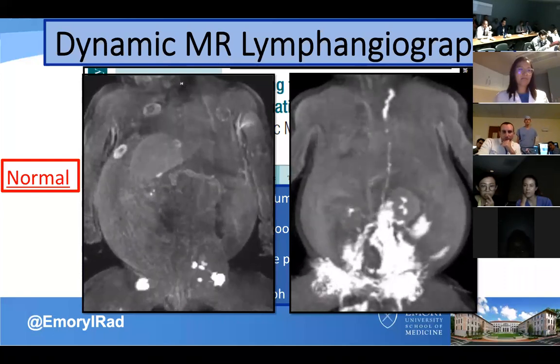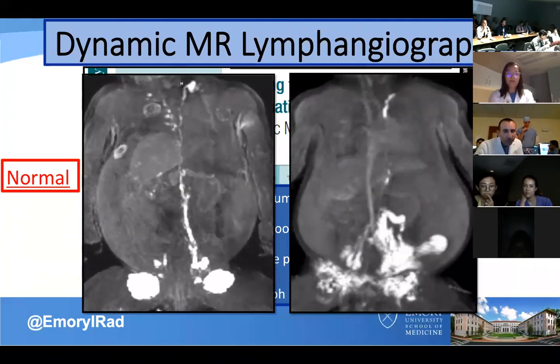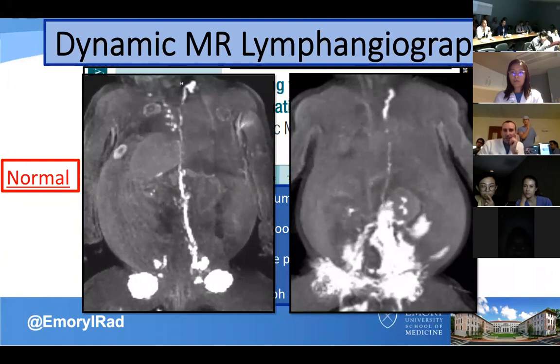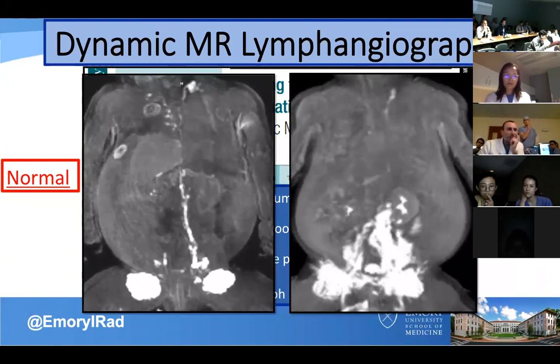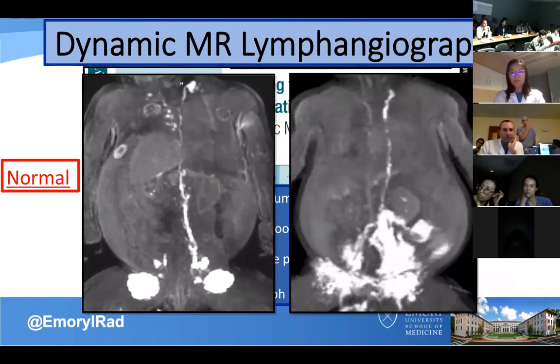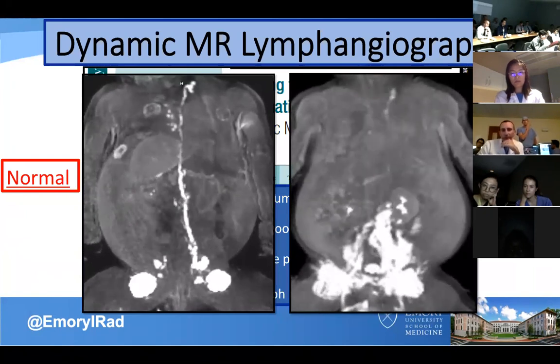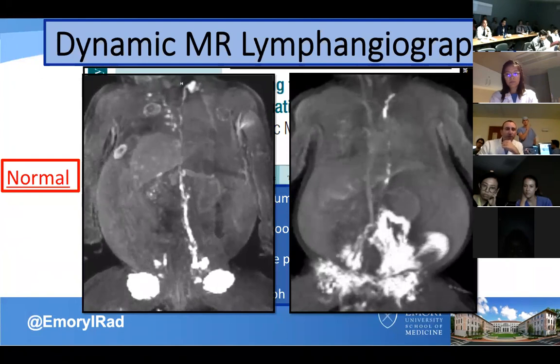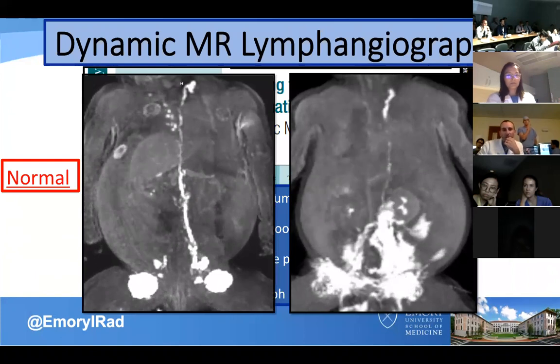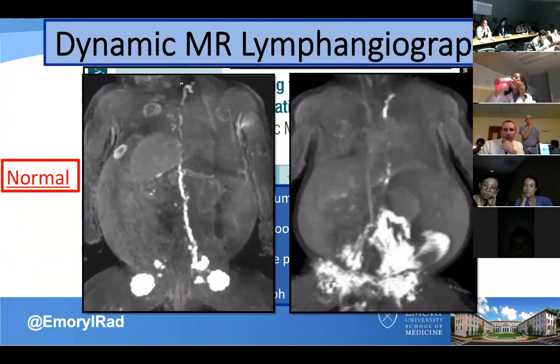We also have a question. When you inject, do you use sonar guidance to make sure that the needle is actually in the lymph node? How do you ensure that you are actually inside the lymph node? Yes, we use ultrasound guidance. You can also use ultrasound contrast to confirm the position outside the MR suite. Some places also will confirm it fluoroscopically and transfer the patient on the MR bed back to the MR. It depends on your setup and what type of MR scanners. If you have beds that can go out to the waiting area, or some place that you can bring an ultrasound or not. The setup is really going to be dependent on what you have available.